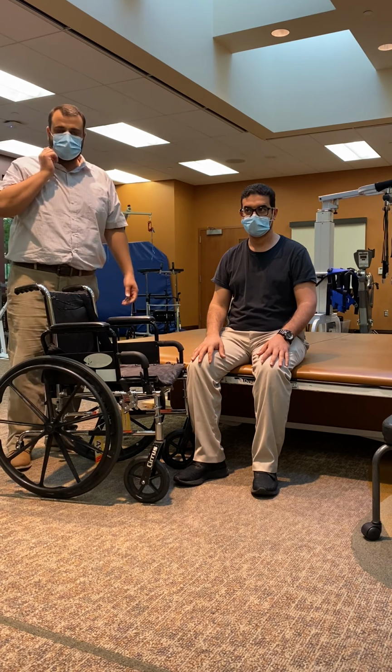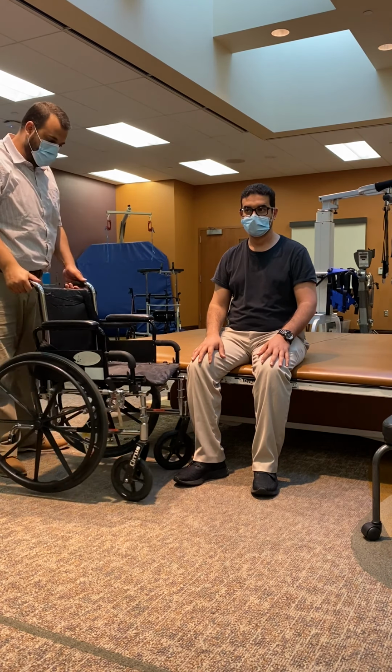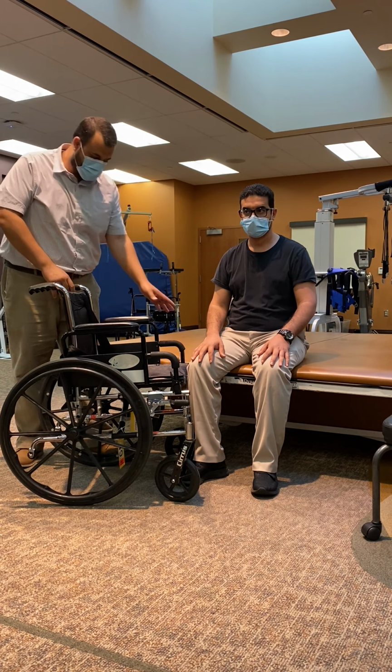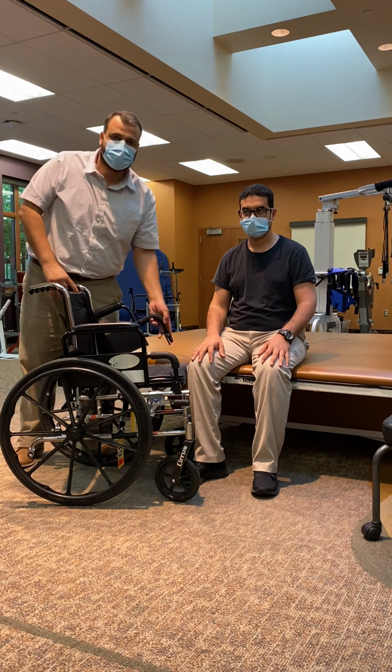So for the wheelchair placement, we have to put the wheelchair always in an angulated position, like 30 to 40 degrees. And we make sure the brakes are on. The footrest has to be swung out, and the armrest has to be taken out also.